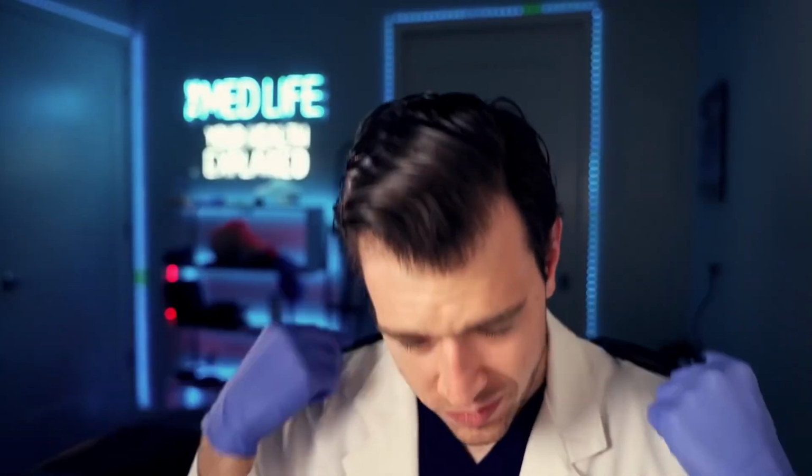Blood pressure today is 126 over 74. I'll take this cuff off for you. I know we've talked before, but the systolic is that higher pressure number and the diastolic is the lower. So you're a touch high today. We look for 120 over 80 or less, but we don't want to go too low, and you're not too terribly high, especially since there was some, I'm sure, anxiety around having to redo the blood pressure, so nothing to worry about for now.